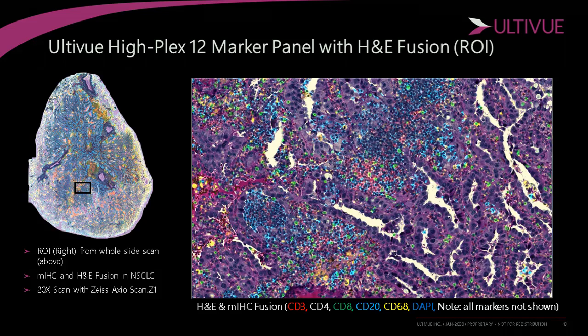So I would say that currently, histopathological tissue analysis by a pathologist really represents the only method for confirmation of presence or absence of disease, for the identification of hot and cold tumors, for example, or disease grading or measurement of disease progression.